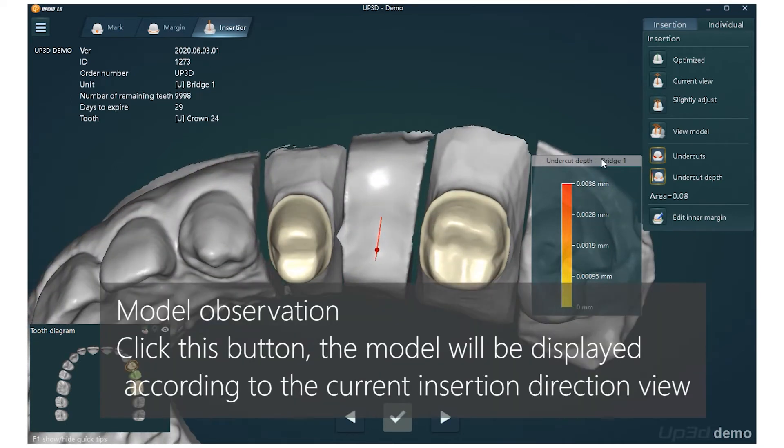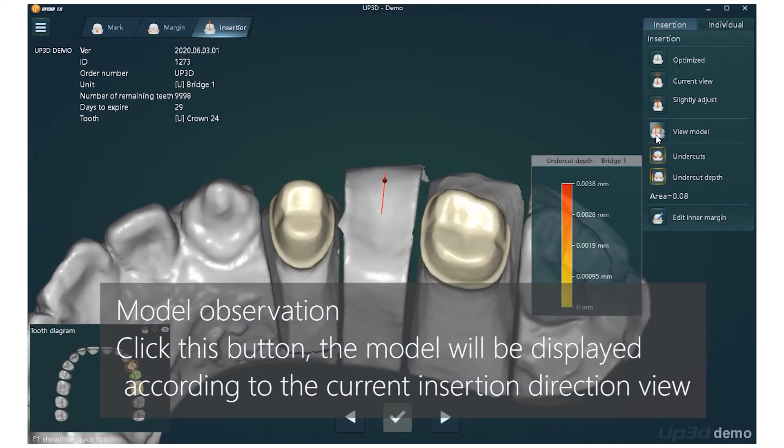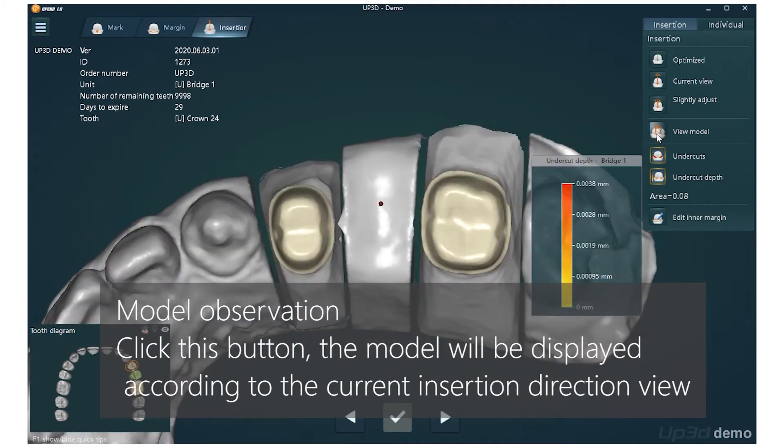Model Observation: Click this button and the model will be displayed according to the current Insertion Direction view.